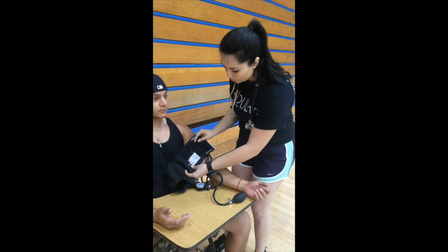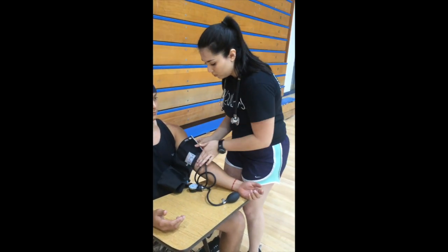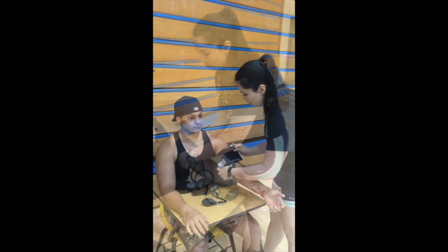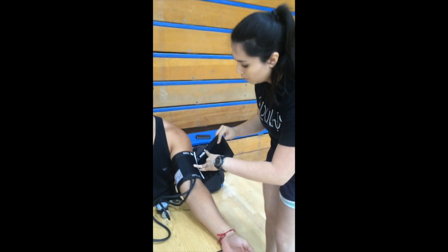Place the cuff 1 inch above the antecubital space. As you wrap the cuff on, make sure the cuff is the proper size by following the outline described earlier. It seems like the cuff is a perfect size.